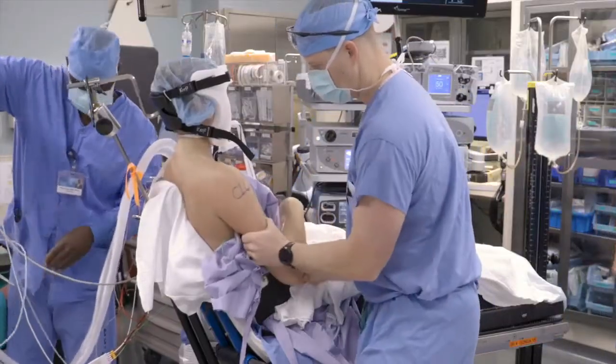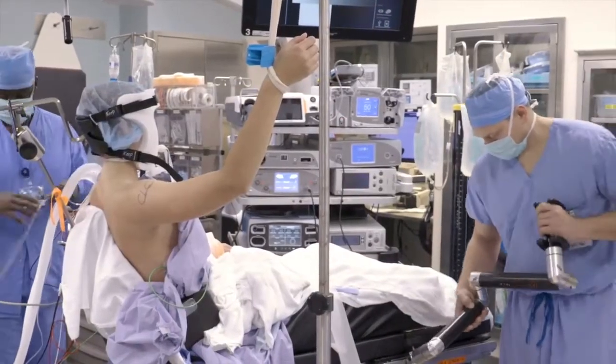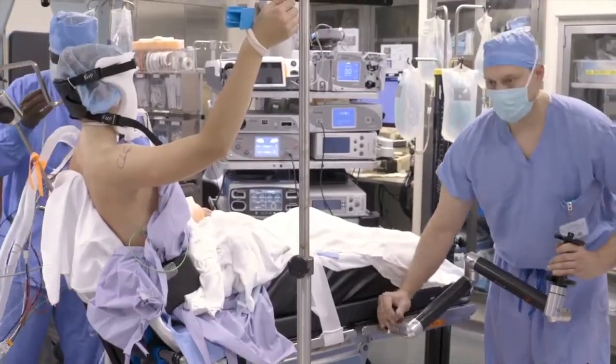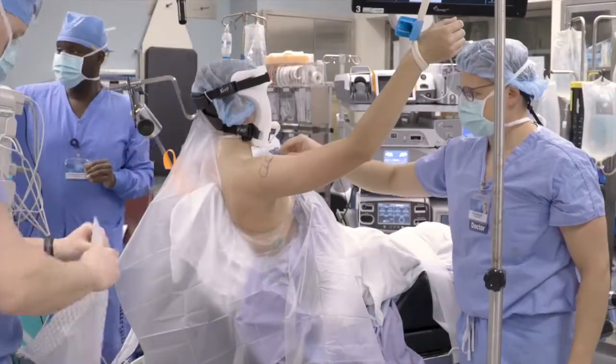The arm is then suspended temporarily using finger traps or stockinette for hands-free holding during prepping and draping. A proprietary mechanical arm holder is then placed at the ipsilateral side railing of the foot of the bed, and we recommend checking to make sure it's able to reach the forearm and facilitates positions that will be used for the case.